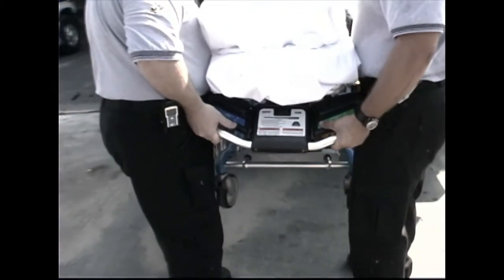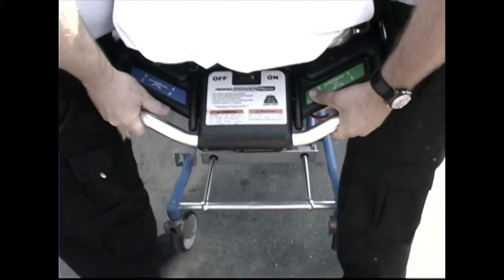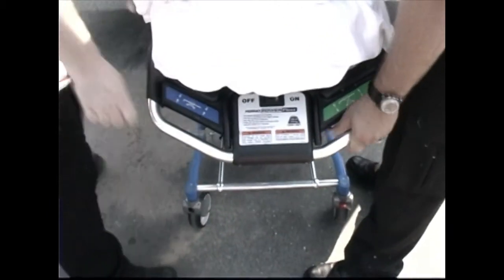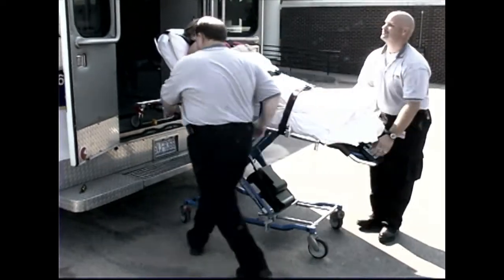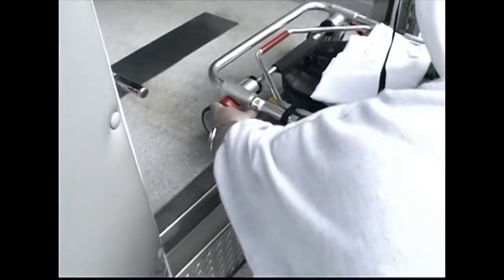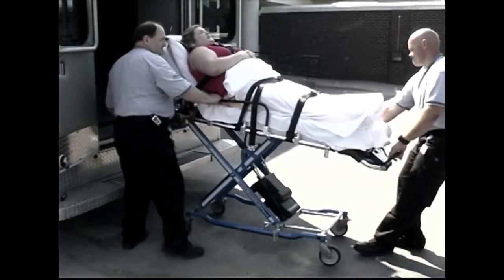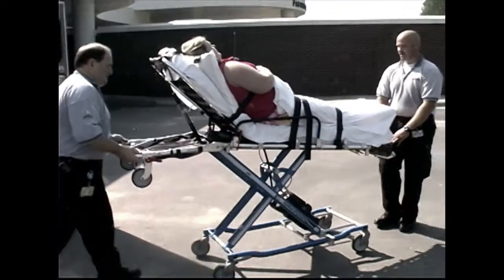Keep the cot raised and level with the ambulance floor. The control operator presses the green raise unload touch pad to extend the legs and releases the touch pad when the wheels touch the ground and the cot is high enough to be released from the safety hook. The assisting operator then moves to the head end of the cot and lifts the red fastener release handle to release the safety bar from the safety hook. Roll the cot completely out of the ambulance and lower the cot to a rolling height.